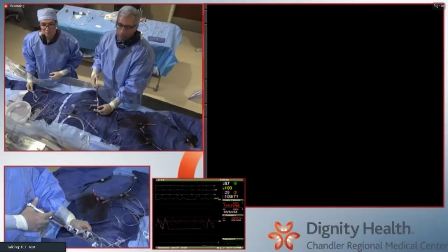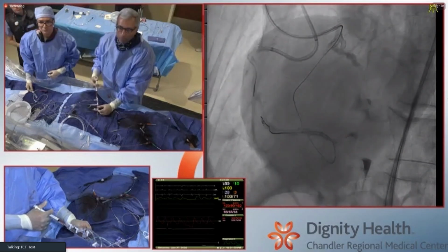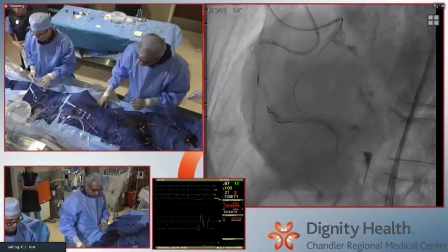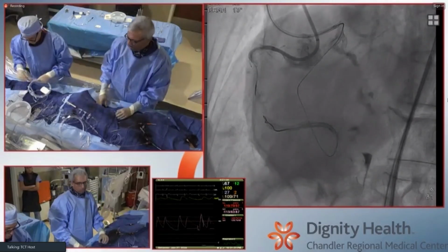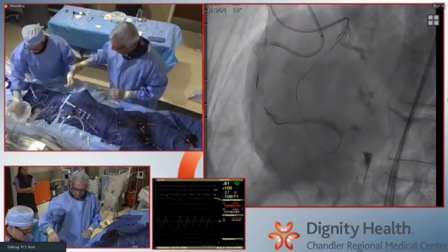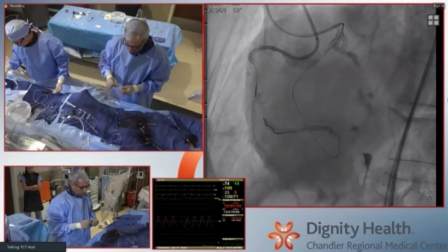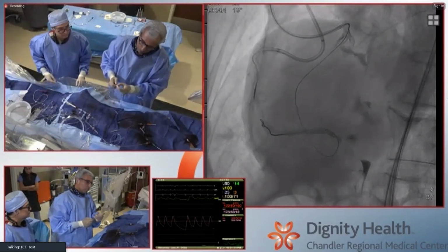It's safe. I guess the only headache is that because the knuckle is so tight, you can catch a side branch and blow out the side of a side branch. If you talk to people like Bill Nicholson, they'll say they typically use Fielder XT for their knuckles now because they're multi-layered, very large knuckles, and the likelihood of going out a side branch is very low. I think it's a philosophical thing. As long as you know where you're going, and there aren't huge side branches in the middle, the risk does go down.